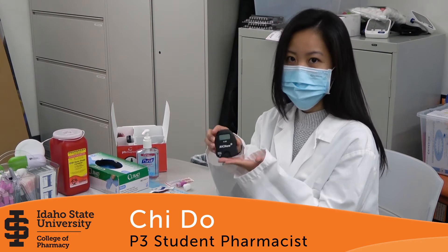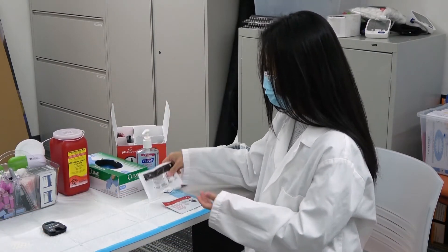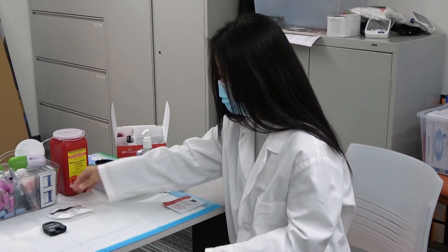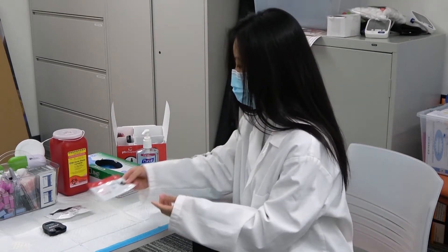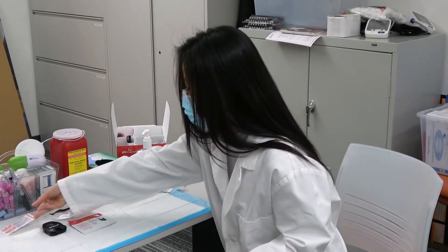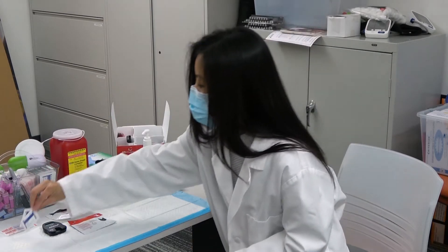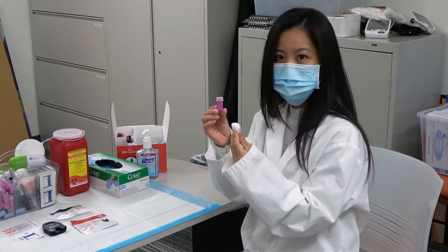Supplies you'll need: an A1C meter, package 1 of 2, package 2 of 2, one band-aid, one alcohol pad, one lancet, and one cotton ball.